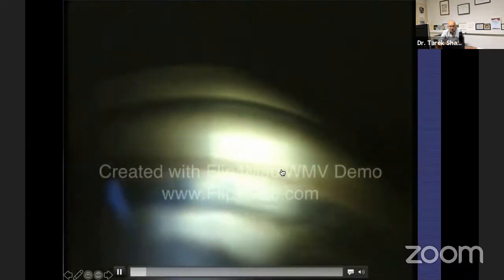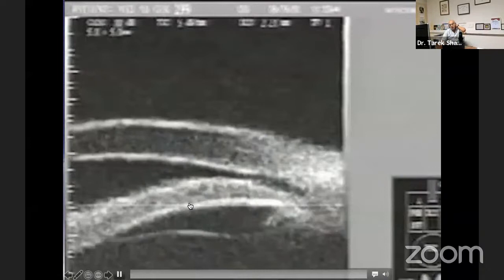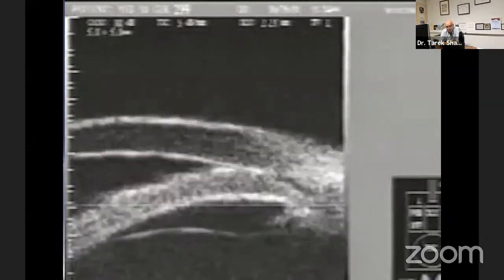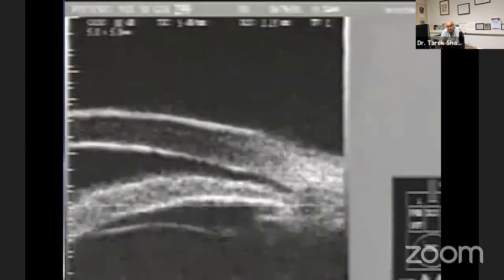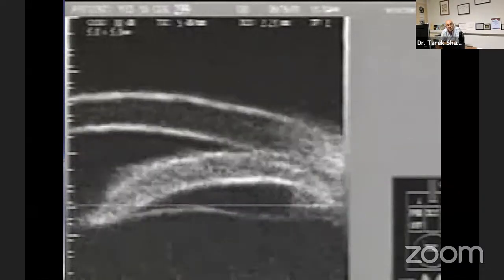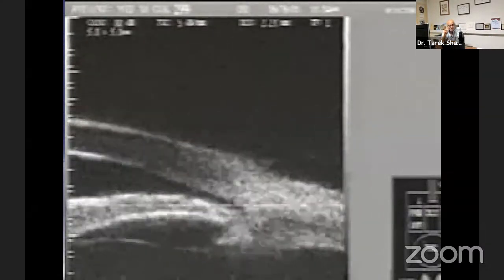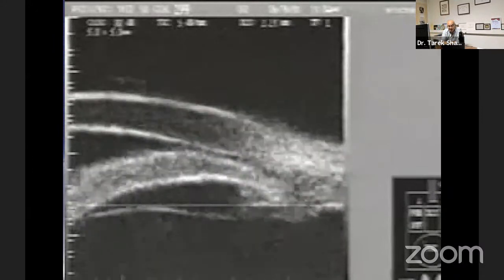In another video, we can see a double hump — one hump here and a second one there — which points toward a potential diagnosis of plateau iris syndrome. UBMs are a fantastic way to confirm what you've seen with gonioscopy. A beautiful UBM video clearly shows what pupillary block is — described by Von Graefe in 1862 without an ophthalmoscope or slit lamp, purely through the genius of his mind.